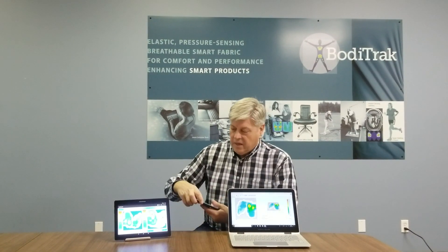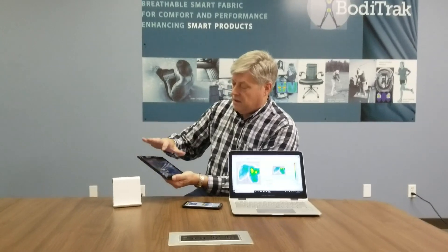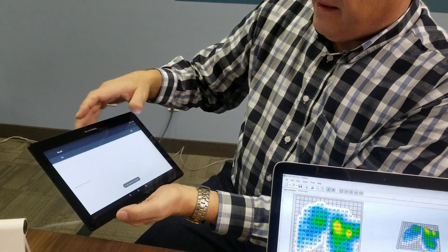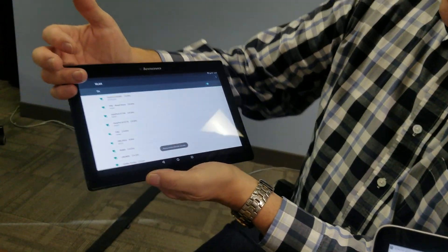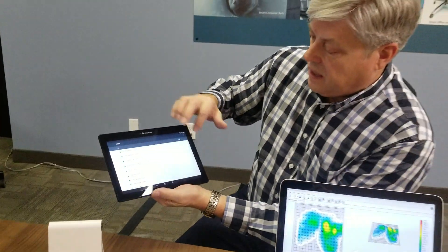Again, as I mentioned earlier, the way that you set this up is you simply go to your wireless list. In this case, I know it's the top one on the list — you're not going to be able to see that probably — but it's now connected again.